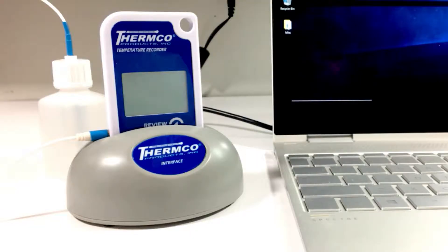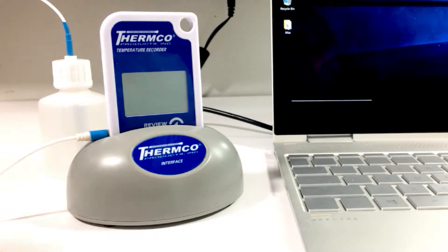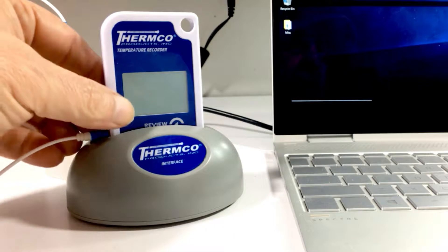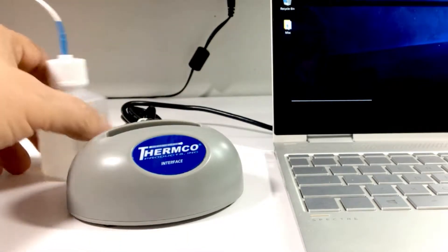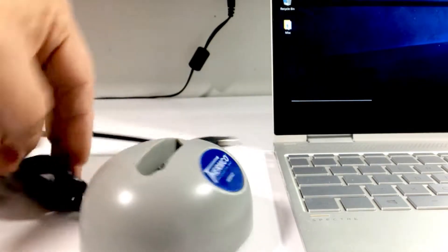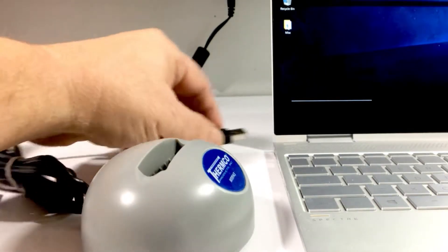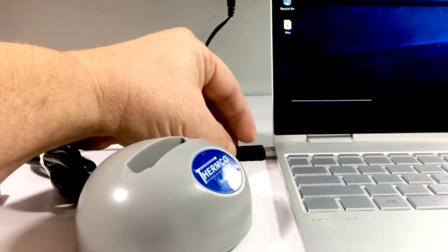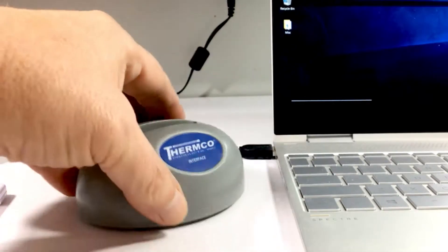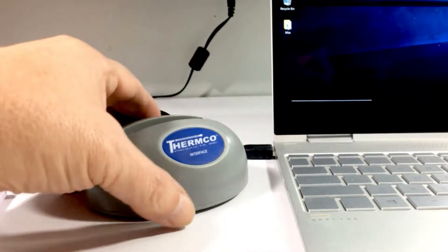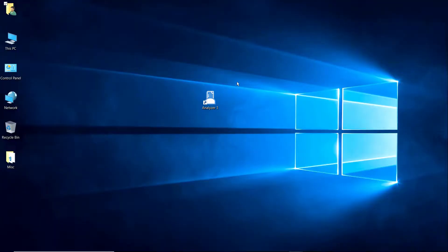Now we're ready to connect the cradle to the USB port of your PC. Make sure you don't have the log tag in. Take your USB and connect it to your PC. Now we can start analyzer 3.